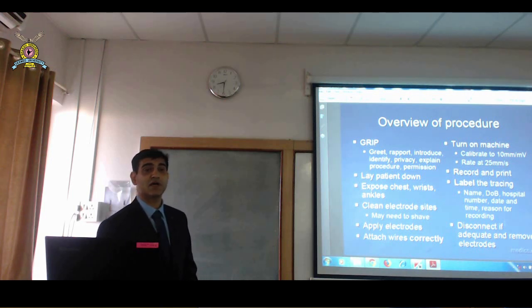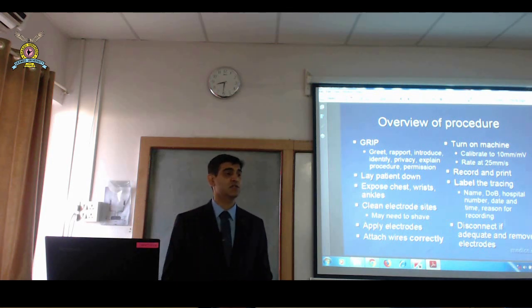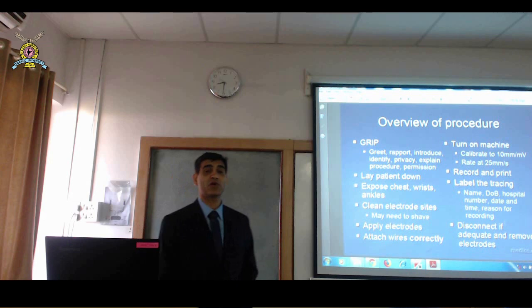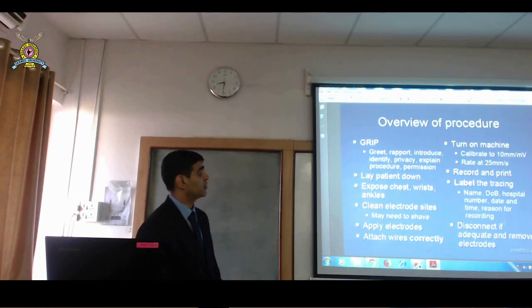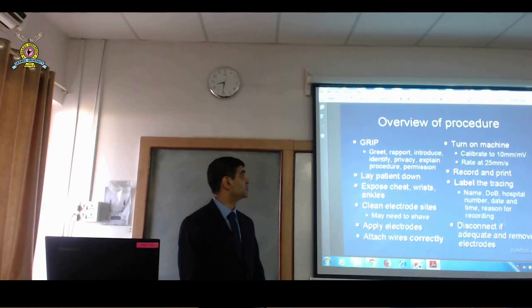But in a general setup, in my private clinic, I have a special room. It's all curtained and private, so people feel happy about it. So you greet them, you develop a rapport with them. You tell them that we're going to do your ECG, and you need to undress for that. These are simple steps, but most people forget about them. You tell them what it involves: we're just going to put the clips on. You need to relax. Simple statements are very useful.